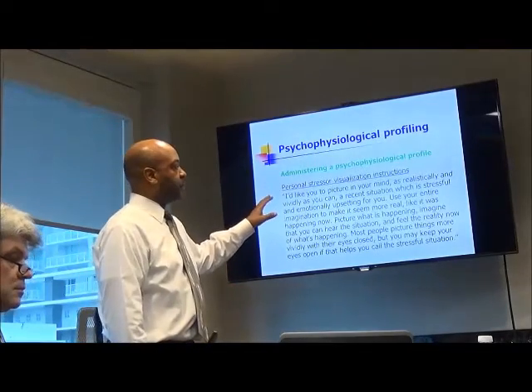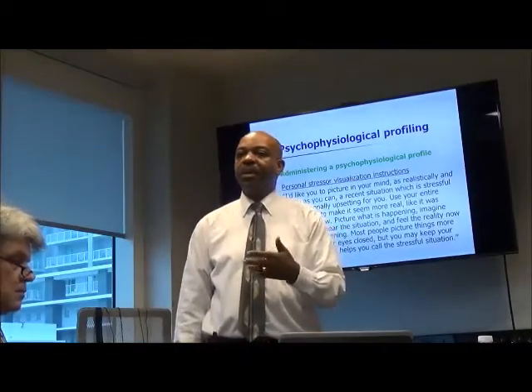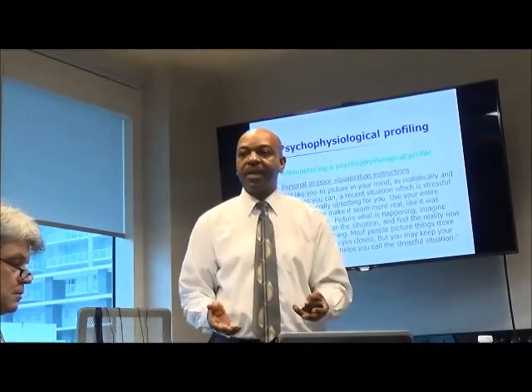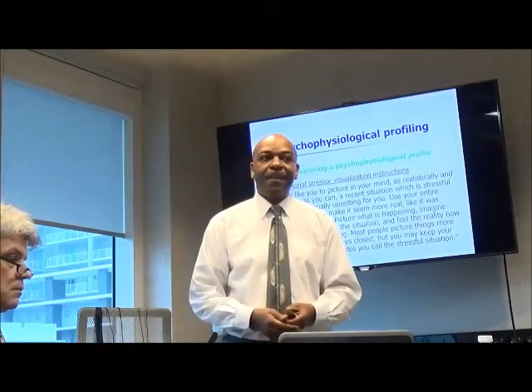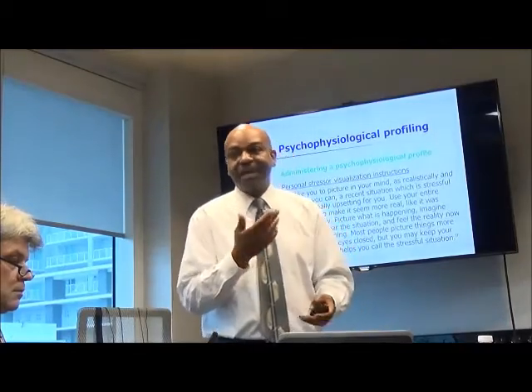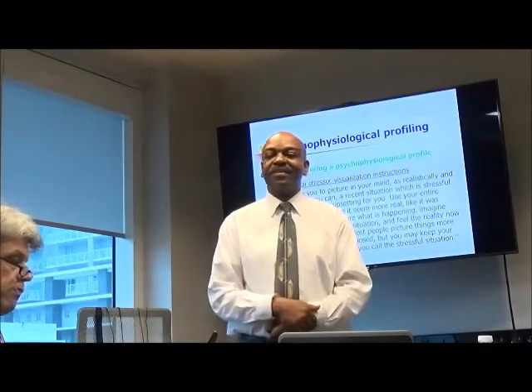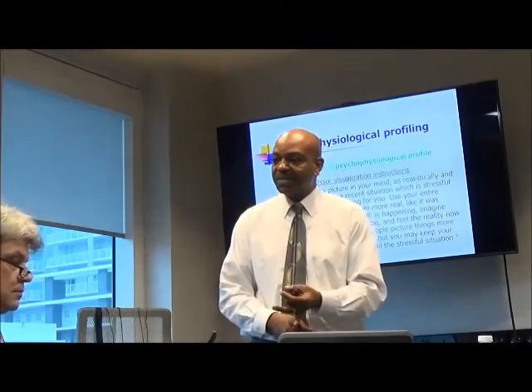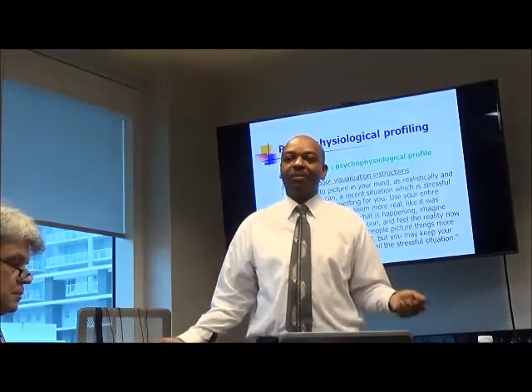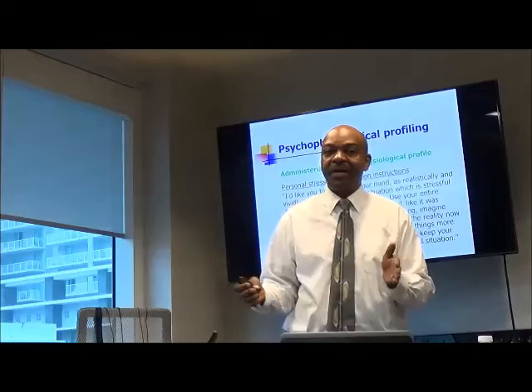During the part where you do the personal stressor, I have some disagreement about this. Some people ask the person to think about, imagine like it's just happening again, a stressful event. And then other people say, I want you to tell me about a stressful event. My opinion is I ask people to tell me about it because I don't know what they're thinking. If they're just sitting there, I don't know if they're thinking about the stressful event, or their groceries, or being on the beach, or I don't want to be here. I don't know what they're thinking. And also, you don't know if they're doing the task for the whole time or not.